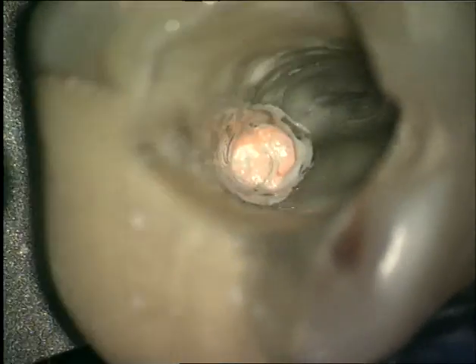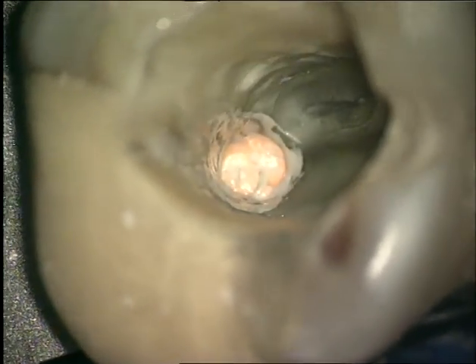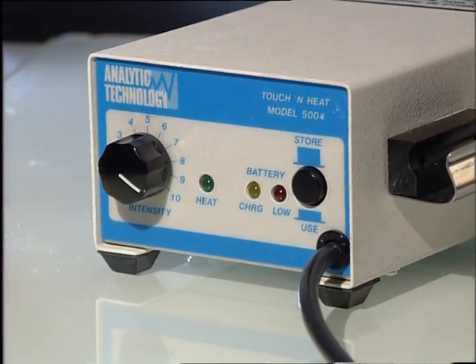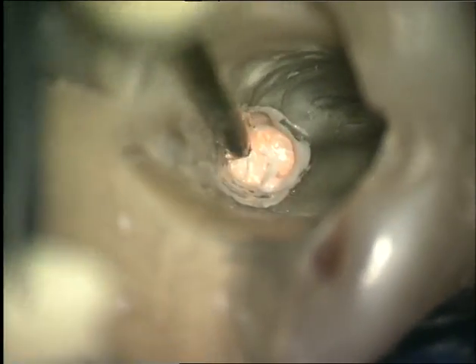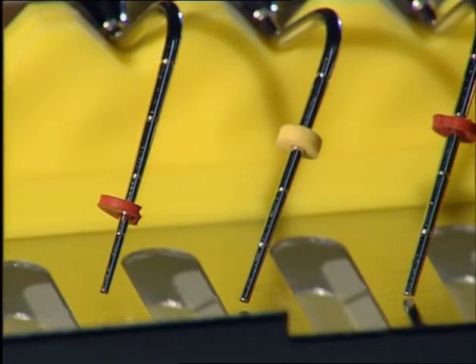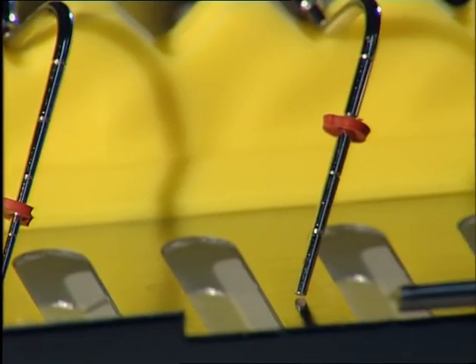The largest pre-fit plugger is used to vertically pack the thermo-softened mass apically. The objective is to capture the maximum cushion of softened material and to move it apically. The probe of the touch and heat unit is activated and allowed to plunge 3 to 4 millimeters into the coronal-most extent of the gutta-percha. The heat carrier is then removed along with an adherent bite of gutta-percha. The plugger is stepped circumferentially around the canal while plugging apically with firm, short strokes.